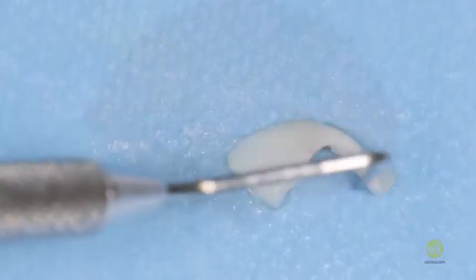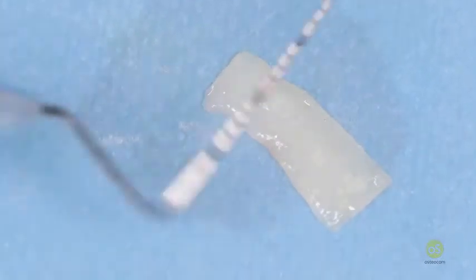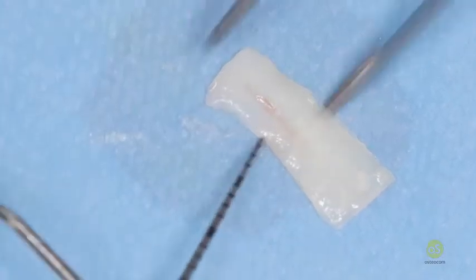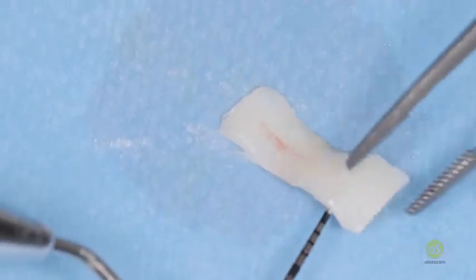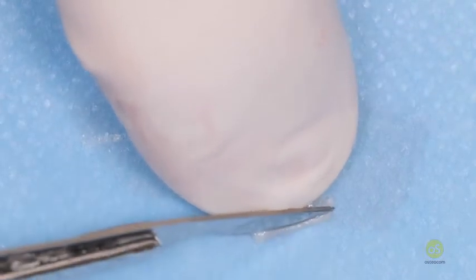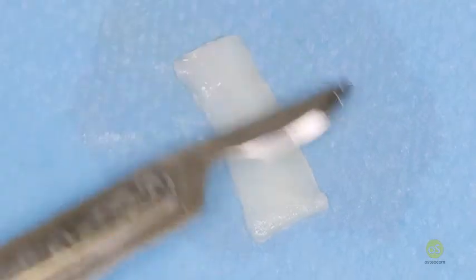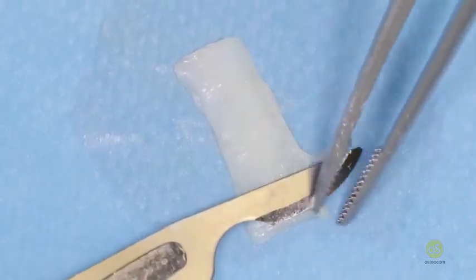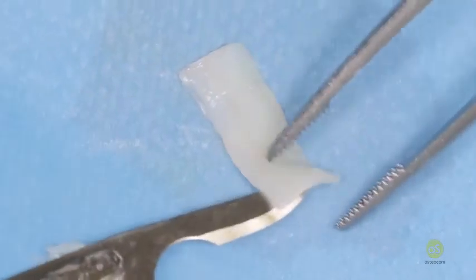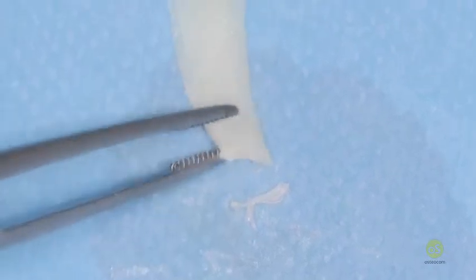Inside and outside is exactly the same story, good properties in quality in adapting to the underlying surface. I will check that there is no epithelium along the vertical incision also, where sometimes we risk to bevel. This is more frequent when you go posterior, where the blade cannot be exactly perpendicular. Okay, now I'm ready for my graft.